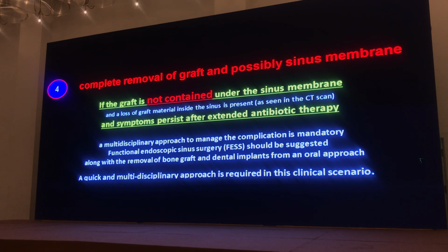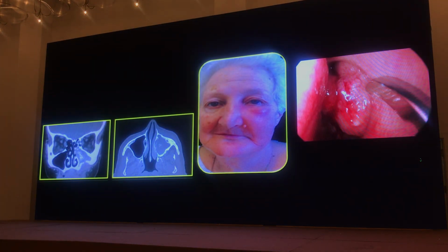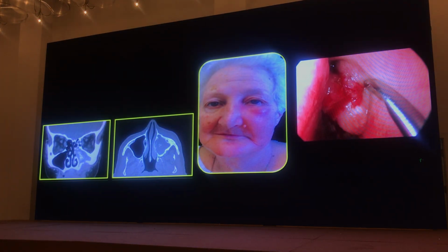And that would involve functional endoscopic sinus surgery. So this is how you deal with this. And you can't just let this rest because you've gone through a series of things. By the time you're here, there's nothing left. If this is where you are, you have to just go back to 0. And it's not that that happens that often, but this is where this case wound up.